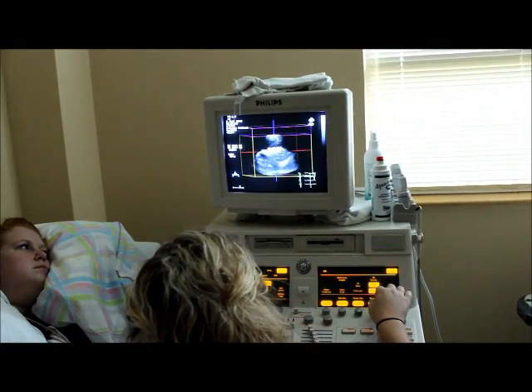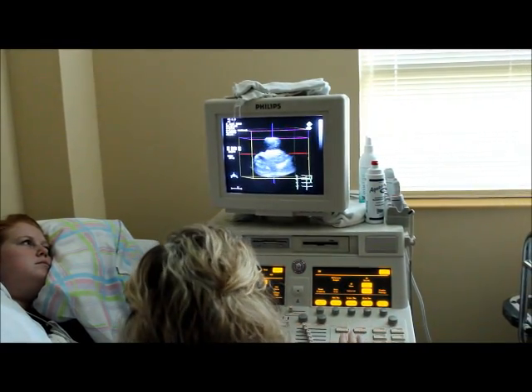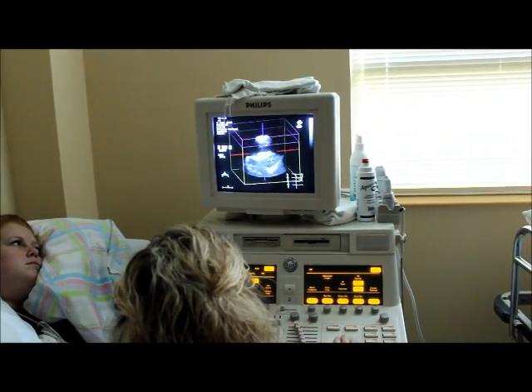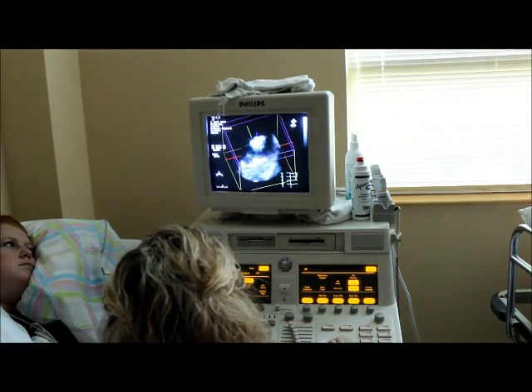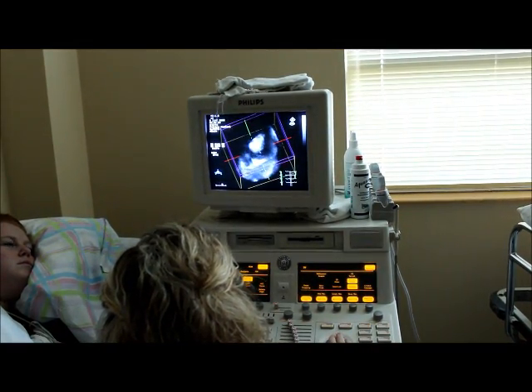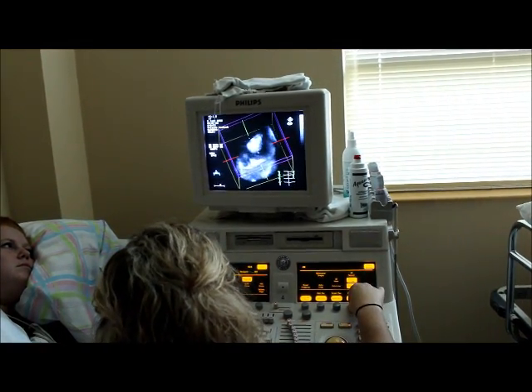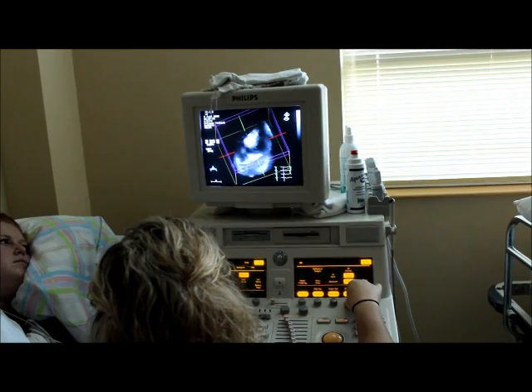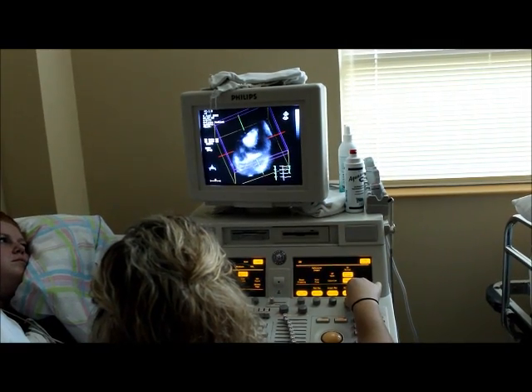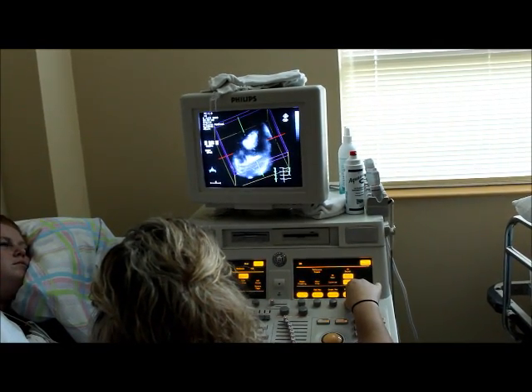Now you're into the RV, so why don't you turn it towards you. Look at the top of that image, look at the top of the RV, and continue to turn the same button that you were, and watch as you look deeper and deeper into the heart.